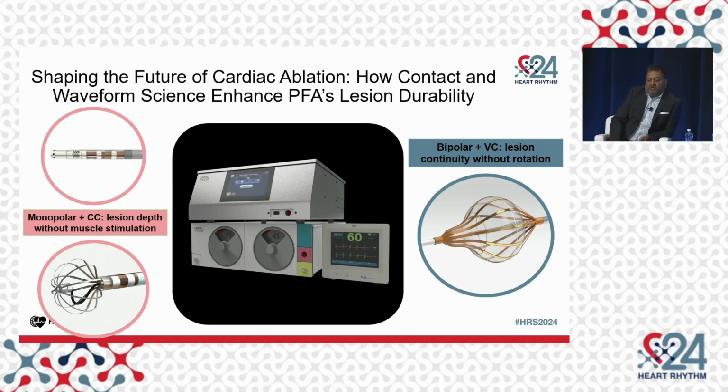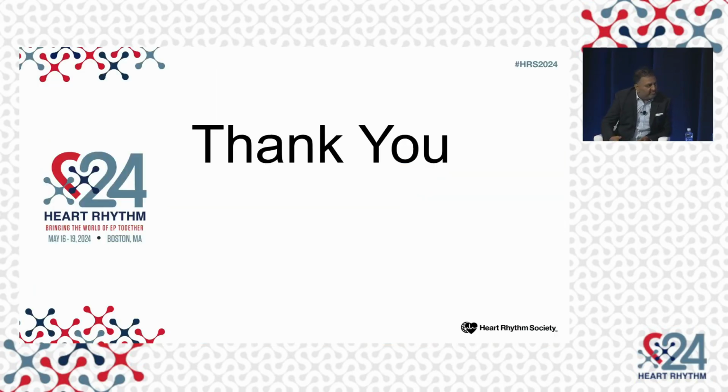This is just a concept, showing some of the things we're going to talk about: using monopolar energy with the correct waveform, with catheters designed as a solid tip focal or large tip focal, and then the concept of bipolar energy for a larger profile catheter that can do more single shot applications. So with that, I'd like to introduce Hiroshi Nakagawa to come up to the stage.